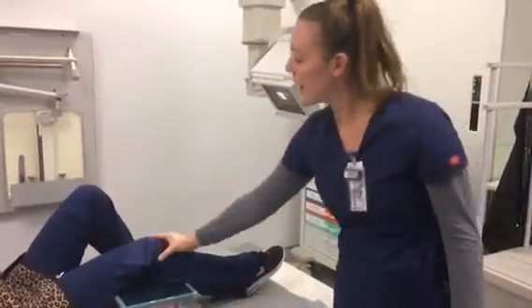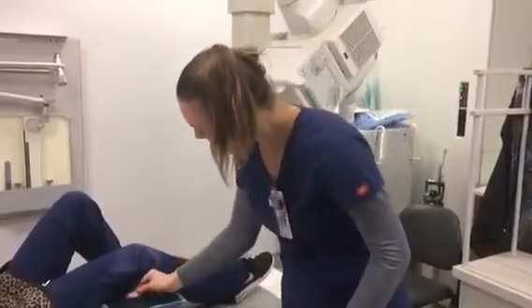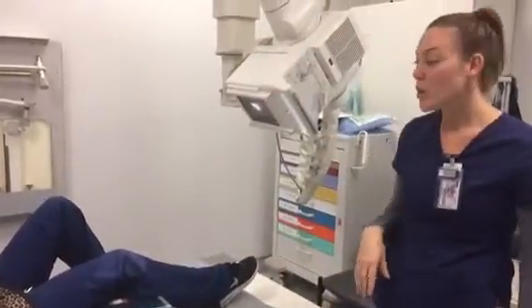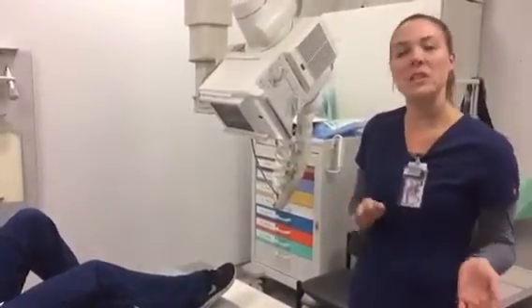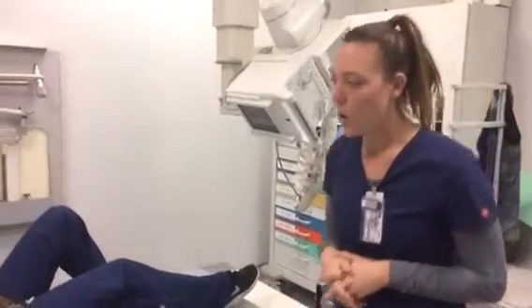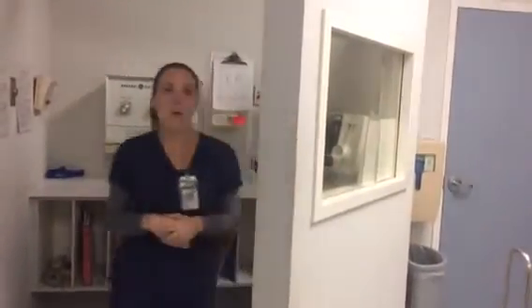We've collimated in just around the knee, and we will appropriately mark our image as well. Because this is a tabletop projection, our technique is going to change from the first 3 images. So this will range between 60 to 65 kVp from 4 to 6 mAs. All right, Ms. Carvajal, stay still. X-ray. Okay, now on to the next image.